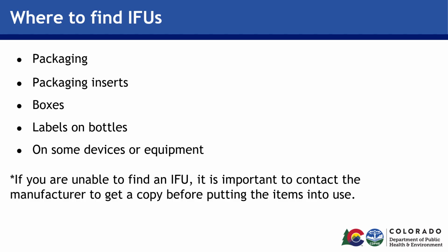In addition to knowing where to find IFUs, in the following slides we'll share examples of labels and what is important to look for when looking at the various IFUs and symbols that can be found on products and medical devices and equipment.